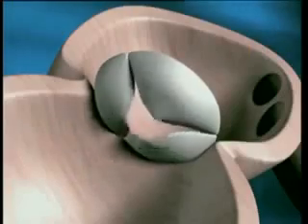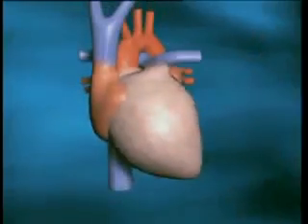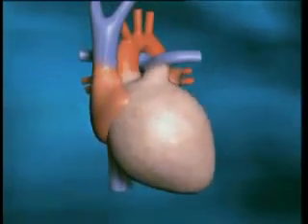Not only do we know that as we age, the waveform changes, or so-called the reflected wave changes. There is such a condition called central aortic pressure, which is the pressure at the root of the heart. The pressure at which, when the heart pumps, the blood comes out. Now this central aortic pressure is very closely related to the stiffness of the artery.